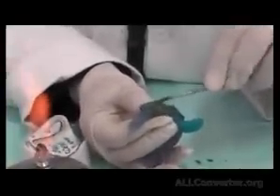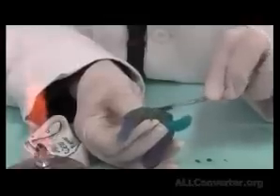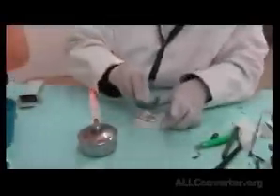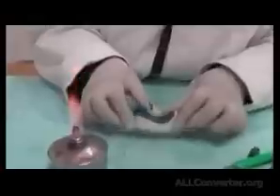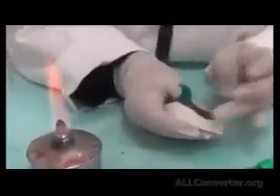Because if we don't remove it, sometimes this excess material on the buccal side or labial side might prevent the material from flowing away from areas where it is long. So we just remove the excess. I would heat it once more, go inside the patient's mouth and further press. And this is why it's called border molding, because the border will be shaping the green stick in its location.